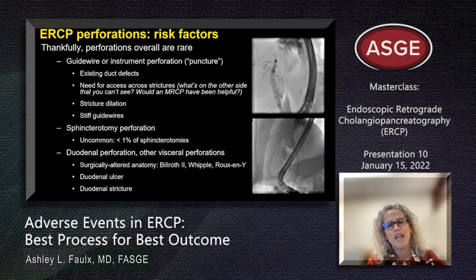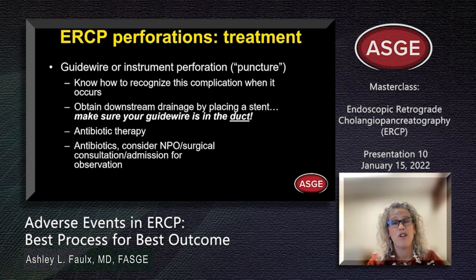So patients can also have duodenal strictures that you may want to try to dilate. I would caution against dilating strictures due to malignancy, just to get in and stent an obstructed duct. I don't think that is wise. That is nothing that's ever going to heal, no matter what kind of thing you try to put in, a stent or overstitch or whatever. You're going to be in big trouble, and I would not recommend that. You want to think in those times about EUS guided rendezvous or stenting through the duodenal bulb or something like that.